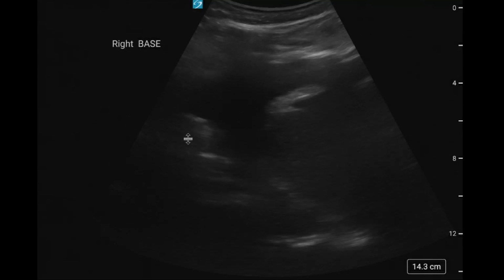This is the liver, and then this anechoic area you're saying, right? This is pleural effusion. So you have a little bit of consolidated lung here, and this anechoic fluid here that's tracing the border of the diaphragm is a pleural effusion. So she did have a drainage catheter in that area. That was one of the chief complaints, that it was leaking. So it's possible that it could have been obstructed, or for some reason it's not fully draining.